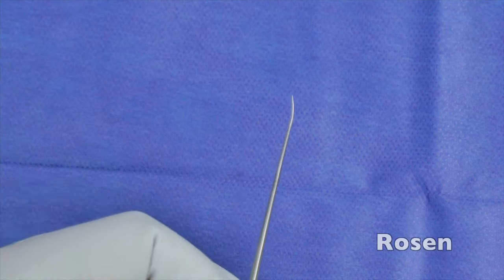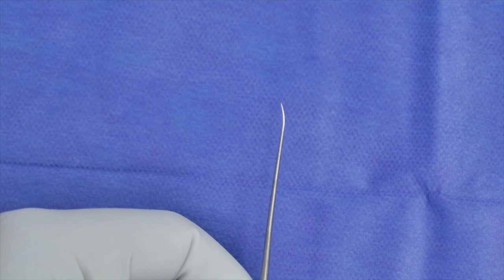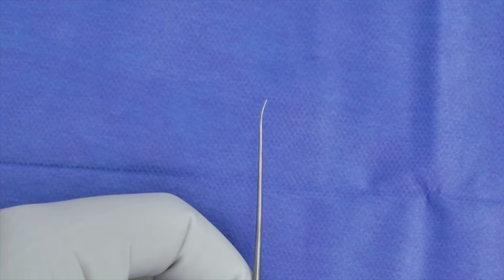This is a Rosen. There are many different ways a Rosen can be bent and different diameters, but it's basically a gently curved pick. This is probably one of the most common instruments that ear surgeons will use for micro-dissection in a lot of different situations.